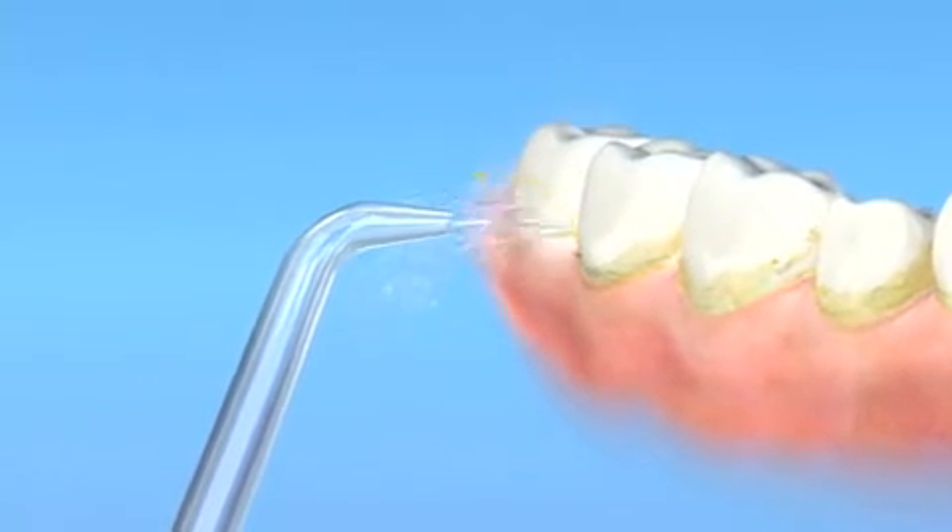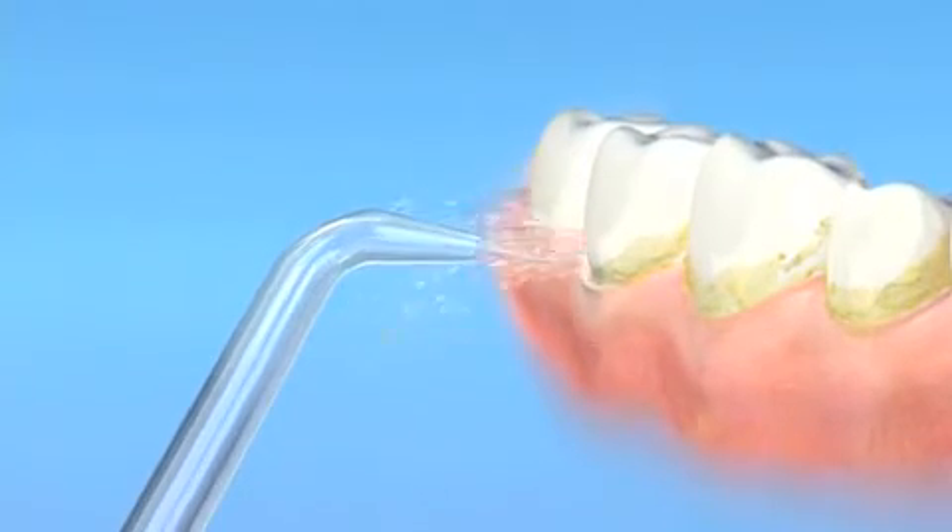The Waterpik Water Flosser removes plaque from deep between your teeth and below your gum line, where traditional brushing and even flossing can't reach.